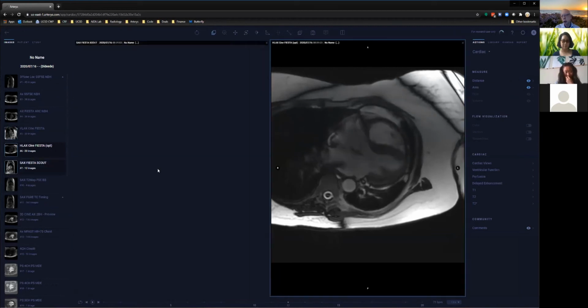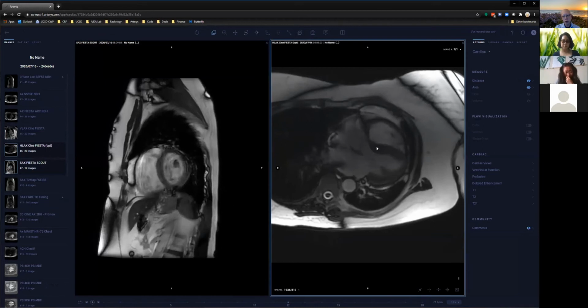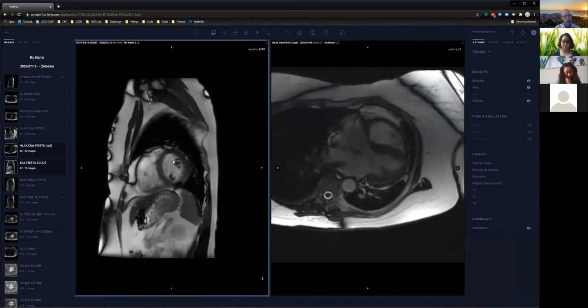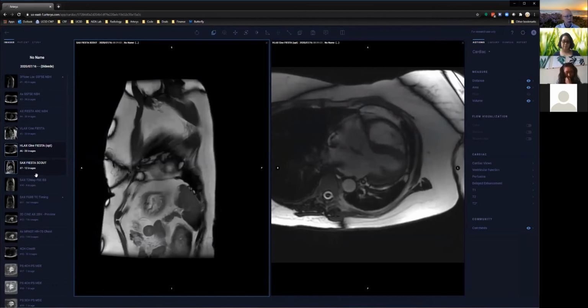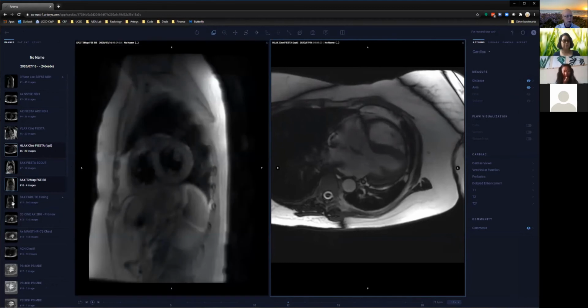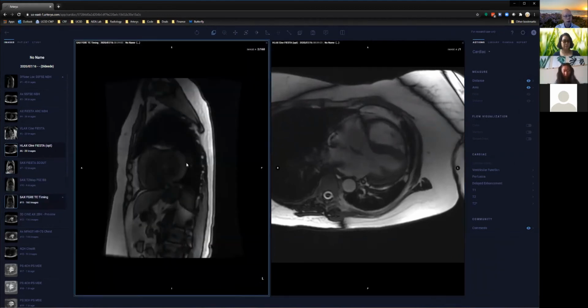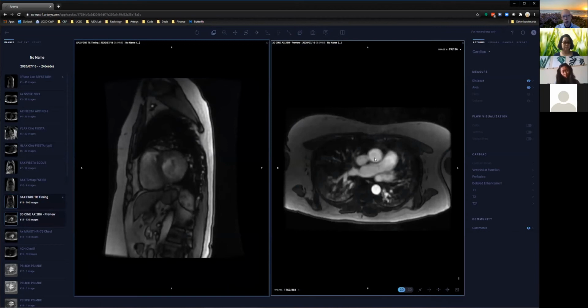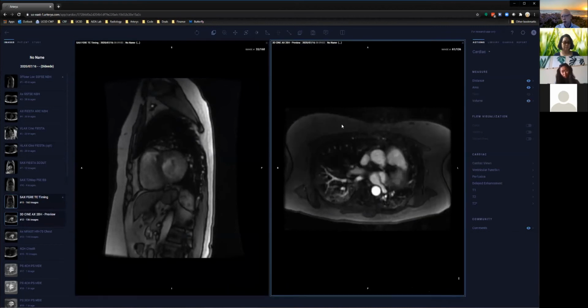Then I'll do a short axis off of these long axis images. This is just a quick non-gated scout survey. That's basically 3 breathholds ahead of a couple other things. We started adding T2 mapping, and there's some functionality for that, and a timing bolus for contrast. And so you'll see that there. That contrast timing bolus gives us a way to prescribe a cardiac gated MRA.